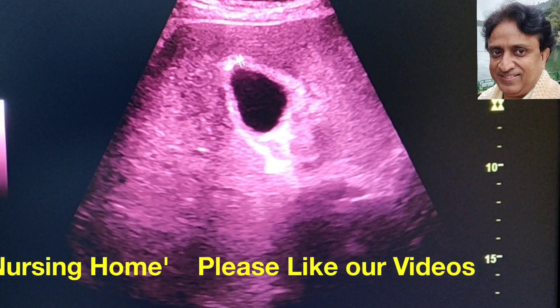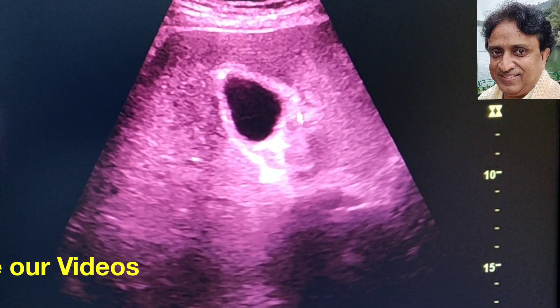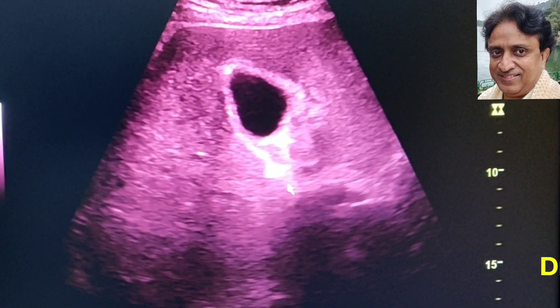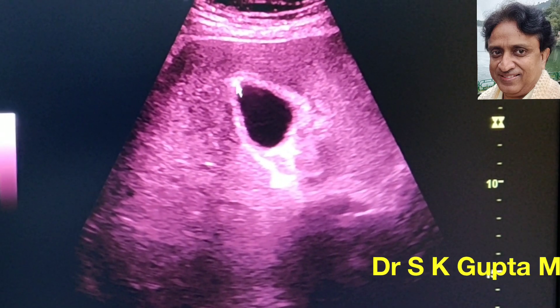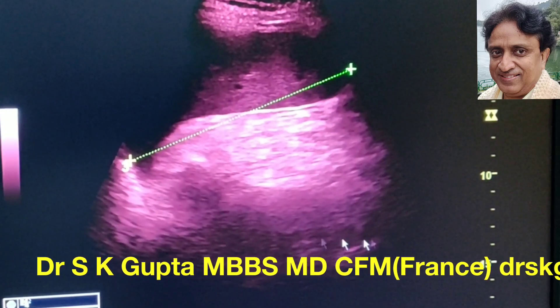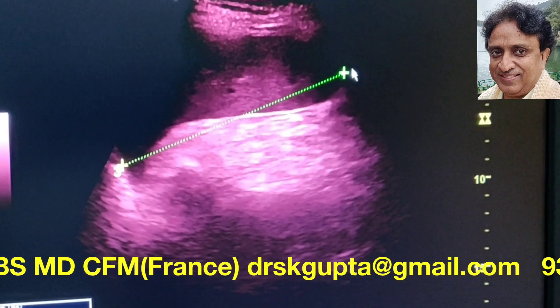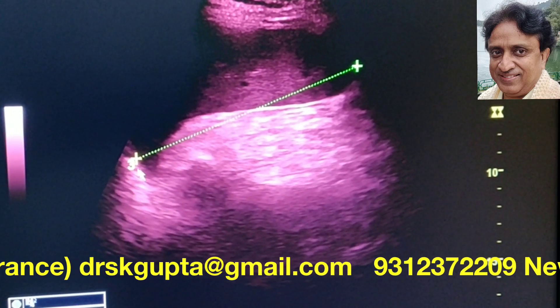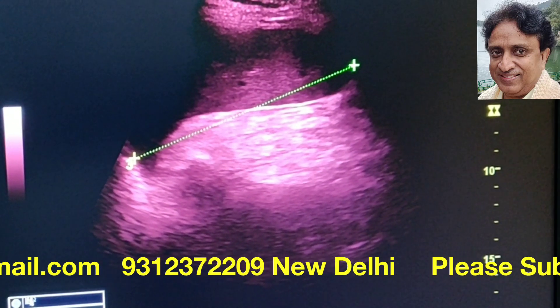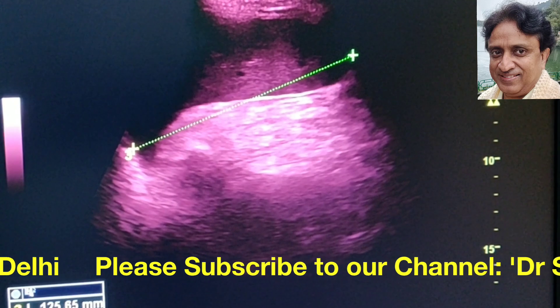You can see the liver parenchyma is hypoechoic and the gallbladder walls are thickened and edematous, which shows there is a hepatitis element going on in the liver along with the liver abscess. The spleen was also enlarged at 125 mm. This patient was later put on intercostal tube drainage.